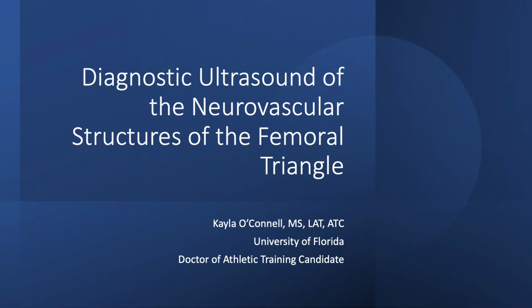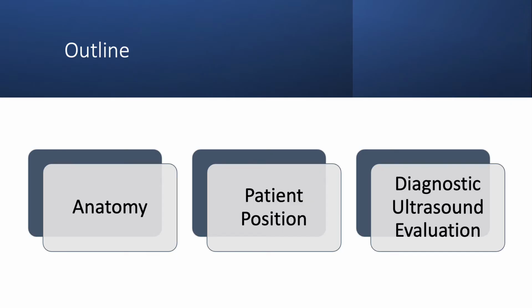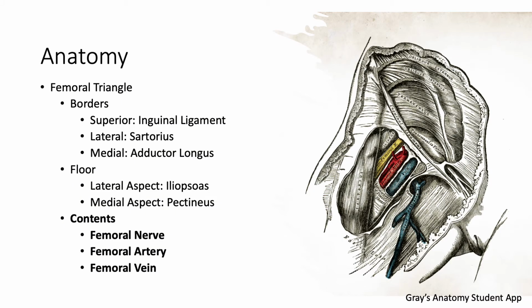My name is Kayla O'Connell, and today I will be instructing the use of diagnostic ultrasound for evaluation of the neurovascular structures of the femoral triangle, including the femoral artery, femoral vein, and femoral nerve. The femoral triangle is located at the proximal aspect of the thigh.